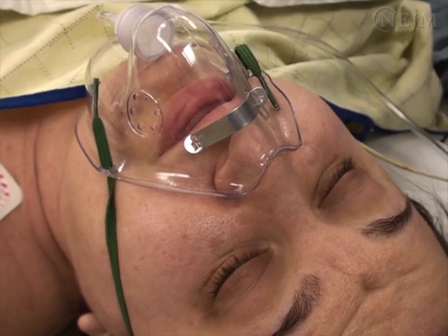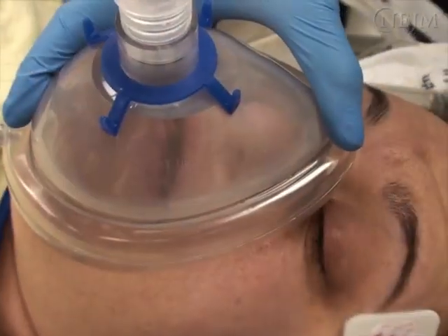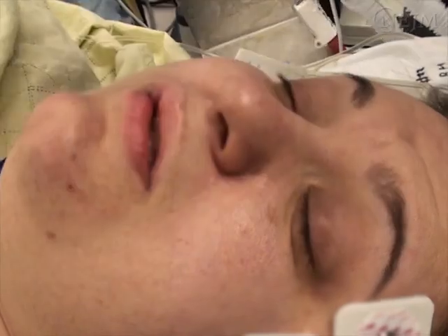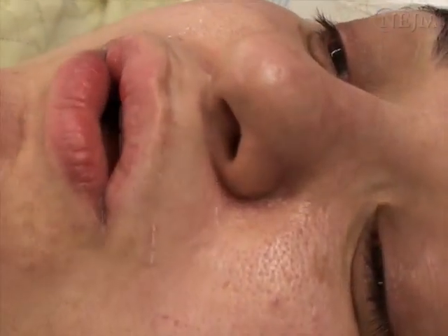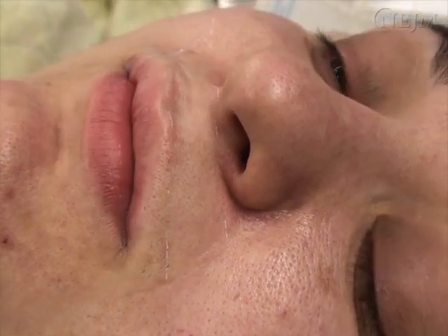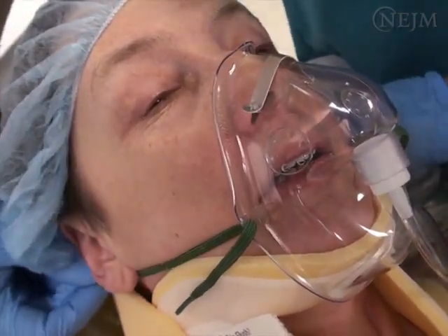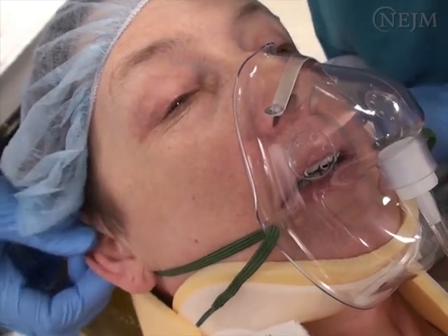Observe the face mask for the rhythmic condensation of exhaled breath. Phonation and speech after extubation are reassuring signs that vocal cord injury and acute glottic edema have largely been prevented. Okay. Continue to provide supplemental oxygen through the face mask until the patient has fully recovered.